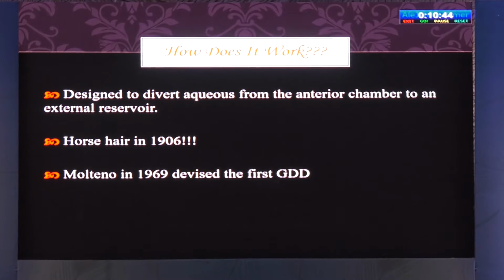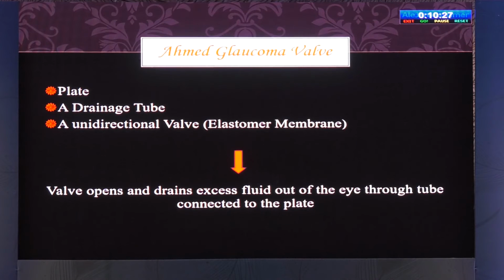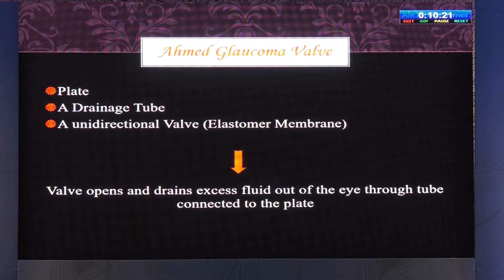It was designed to divert the aqueous, and you would be surprised to know that in 1906, horsehair was the first implant used to divert the aqueous from the anterior chamber. Molteno in 1969 devised the first GDD, and it has undergone many modifications since then. So what does it have? It has a tube, a drainage plate, and a valve. This valve opens and drains the excess fluid out of the eye.